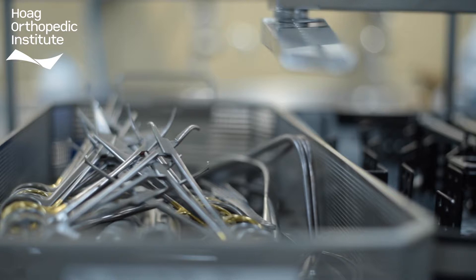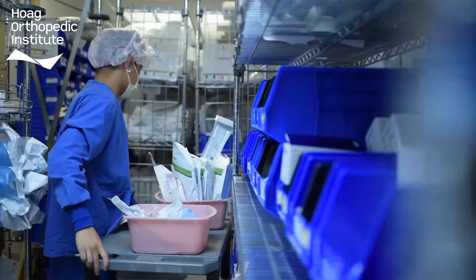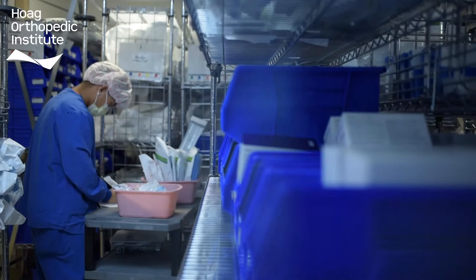Each day hundreds of instruments are processed and the sterile processing techs are specially trained on the multitude of ways to clean them. It is up to them to ensure that each instrument used is safe for the next patient.